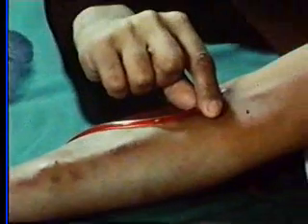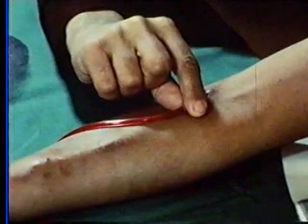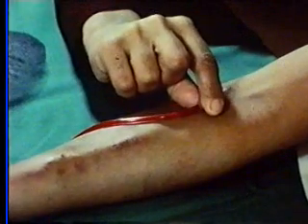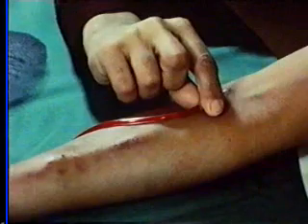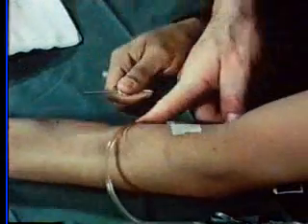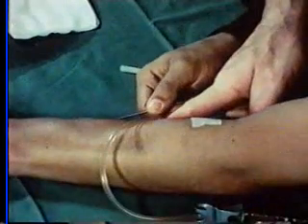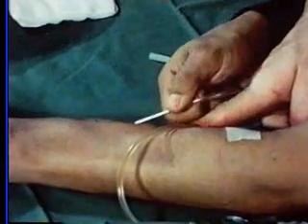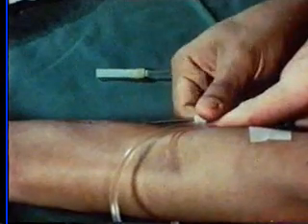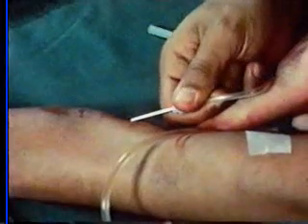There should be a free flow of blood backwards and forwards and no swelling around the puncture site. The patient's brother now comes round and stands behind him, steadying the skin of the forearm with a finger. The second needle is always inserted below the first one, either pointing towards the fistula or up the arm. A clamp has been deliberately left off the needle so that a free flow of blood will be visually demonstrated.